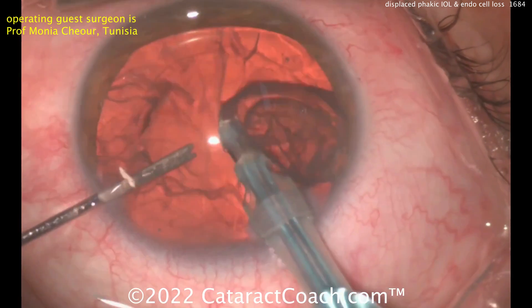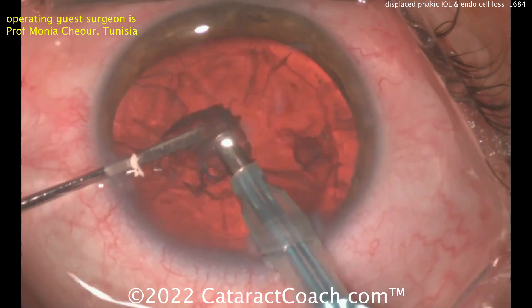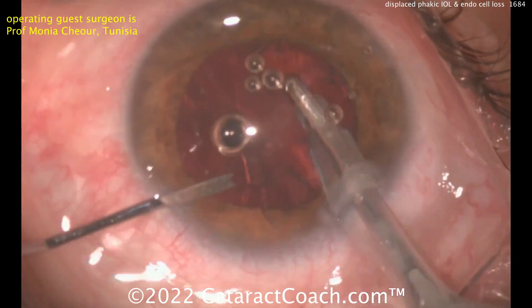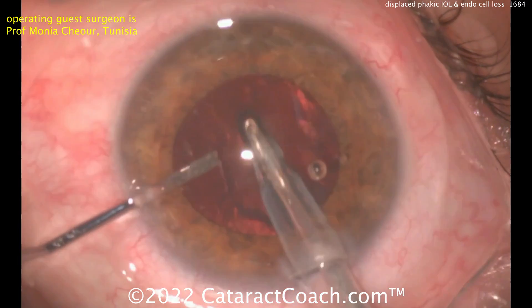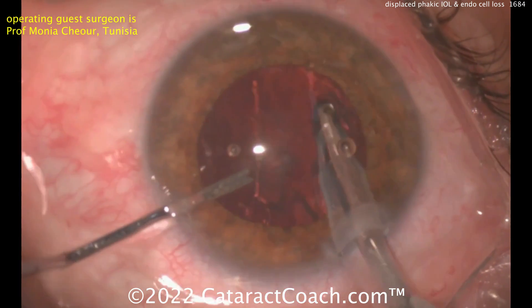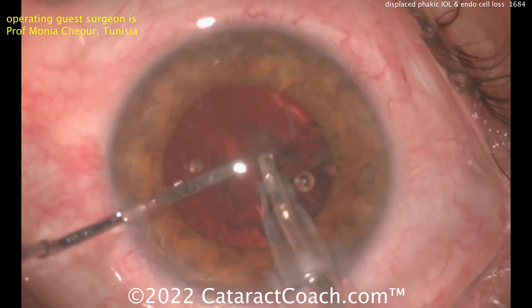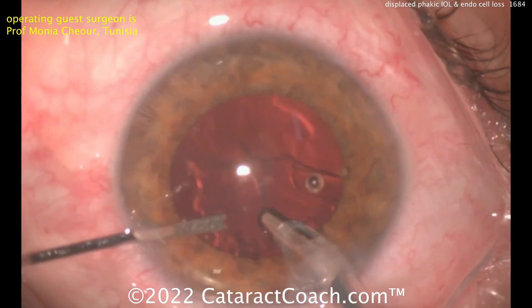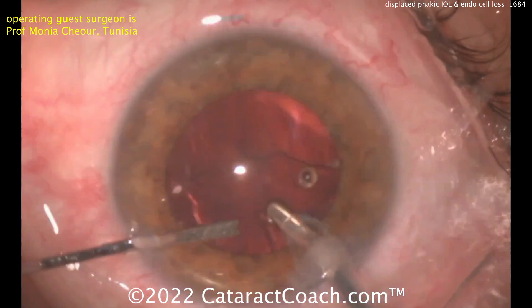Young patients like this are also more likely to need a YAG laser capsulotomy for posterior capsule opacification. At the end of the case, you can take out the cortex and clean this up pretty nicely. Again, watch the patient carefully in the post-op period. Make sure the posterior segment and retinal periphery are very stable with no issues.